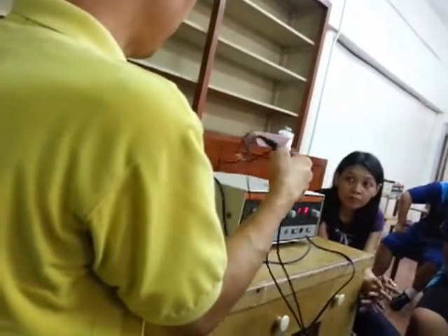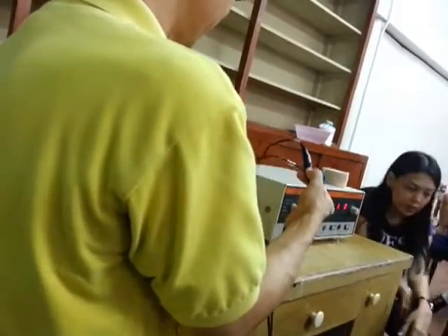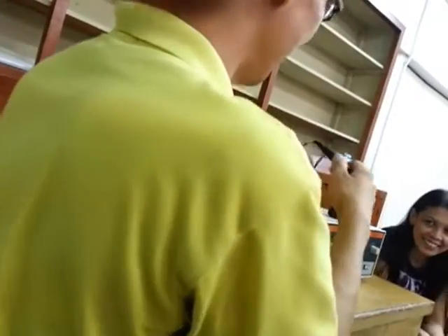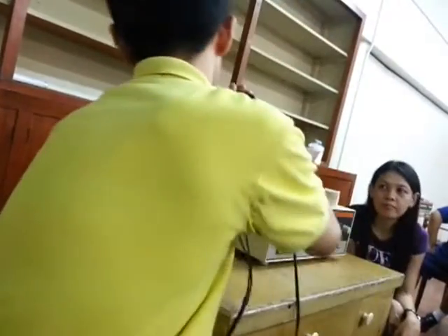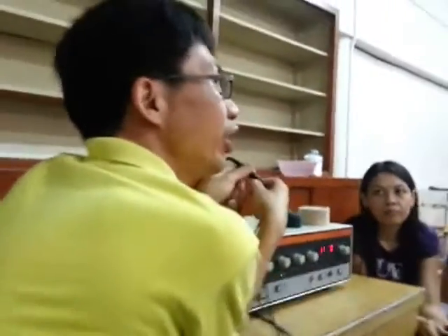We usually apply the cathode on the area wherein you have the location of the nerve trunk.